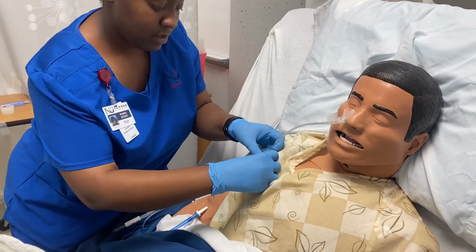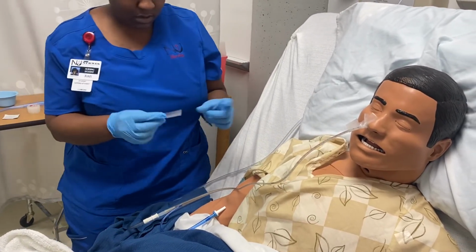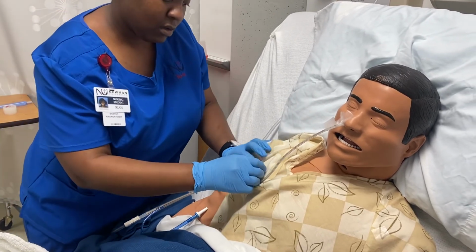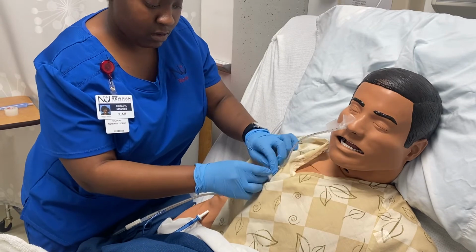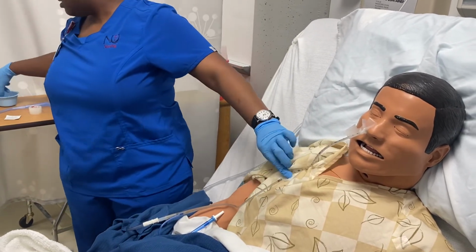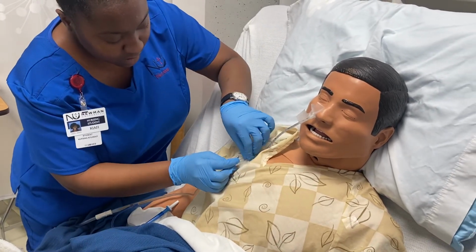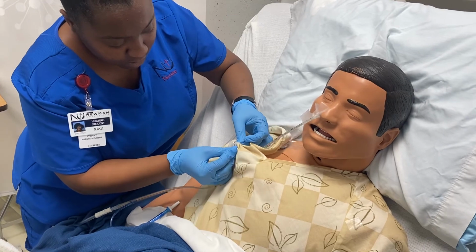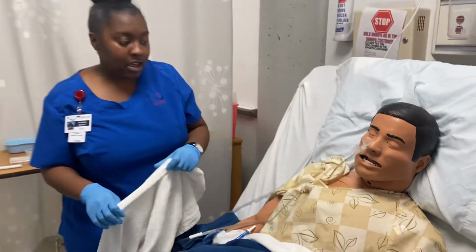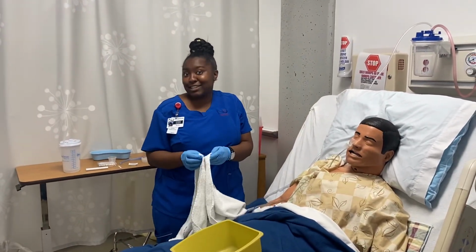Now it's secured to the gown. Perfect. And then I would just check on the patient in like 10 to 15 minutes to make sure everything's going good. And that's the end of my NG tube video.